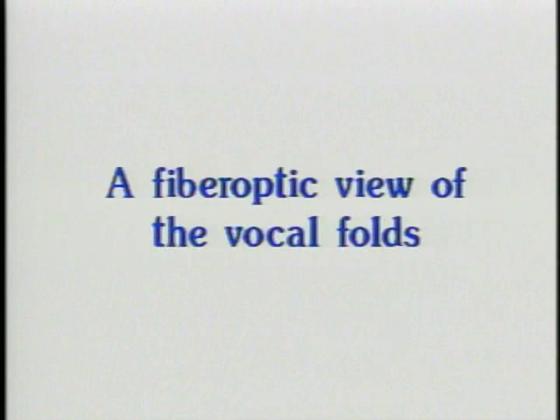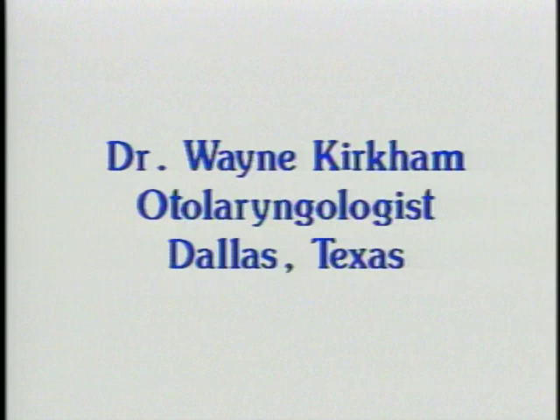In this film, we will see the actual vocal folds of a singer as she speaks and sings. We are able to do this by using a fiber optic endoscope. A fiber optic endoscope is a video camera that records through a thin tube that has a light shining at the end.